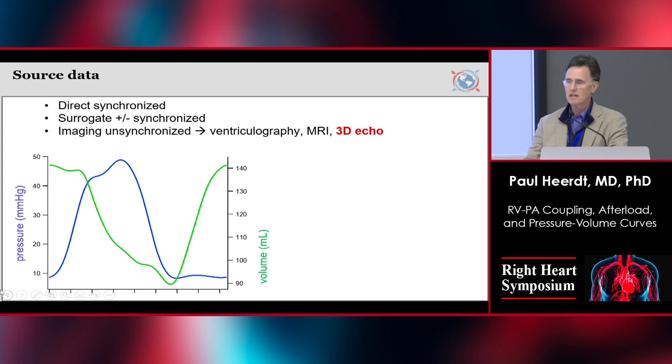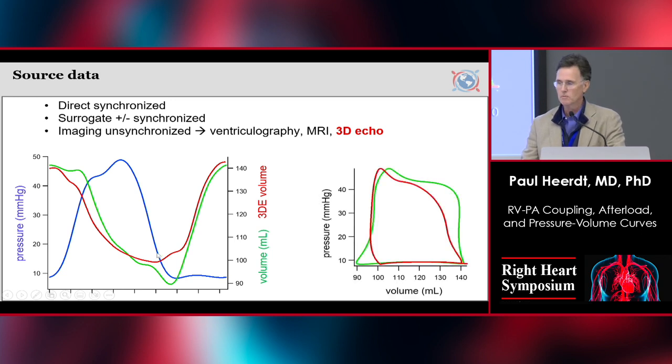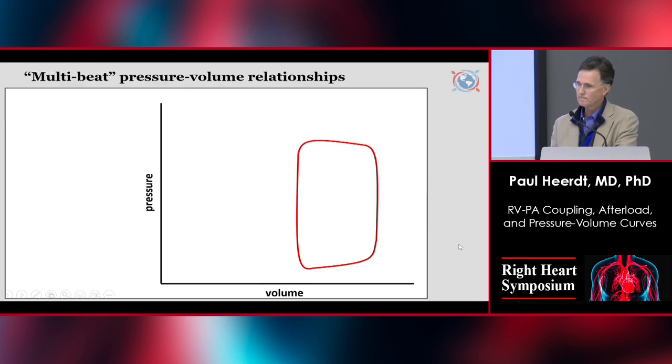This is an example of a clinical study that we actually have going, using conductance catheters in humans. The green is volume again. And this is the simultaneous 3D echo volume. And you can say there are some similarities between them, but if we actually create a pressure-volume loop here, they give a little bit of different interpretation. For example, I'm not sure what this late drop in volume is that we see in the conductance. And also, secondarily, if we look here, it looks like we're having an early loss or ejection of volume as the heart contracts, as if potentially we have tricuspid regurgitation, a finding that isn't apparent on the conductance volume.